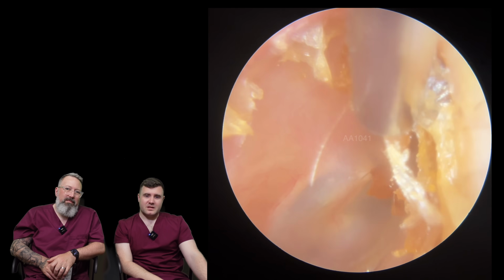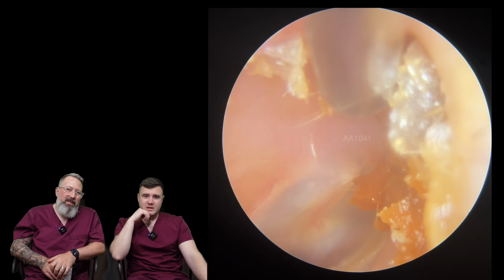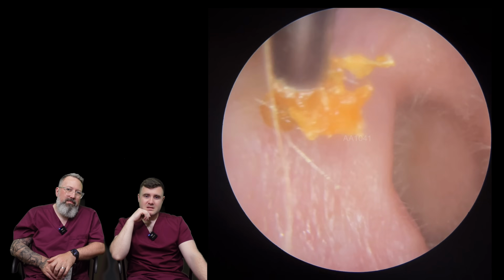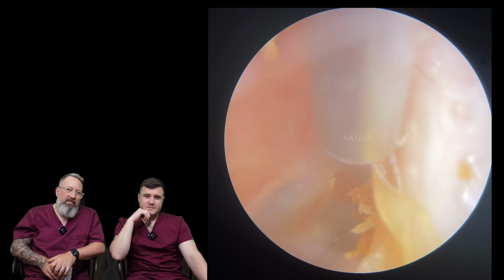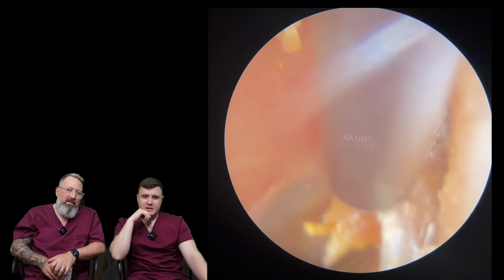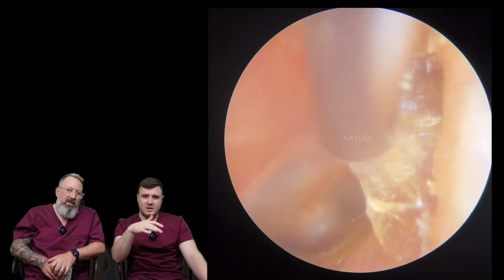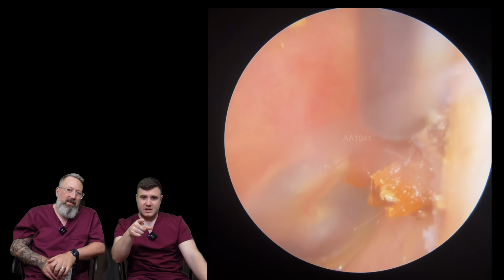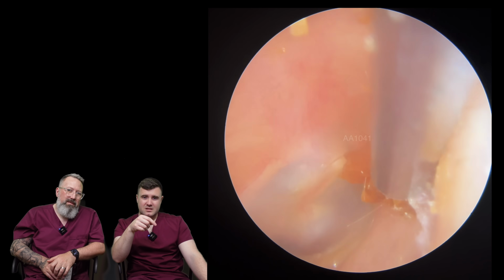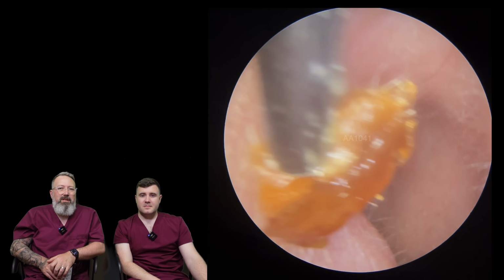Got to be careful here, because that little bend there now is where we're just getting to that sort of bony portion in the ear canal. It's nearly there. Yeah, just got to try and shear it now. I don't want it to start peeling all the way down the ear canal. Yeah, you can see it just starting to tear away there. There's a little bit of wax behind it. There we go. Oh, that came away well. Yeah, lovely. I didn't think that was going to come away well.